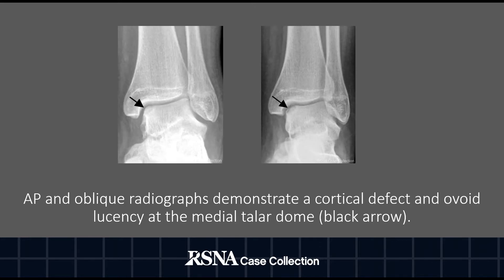On the AP and oblique radiographs, there is a cortical defect and ovoid lucency at the medial talar dome, indicated by black arrows.